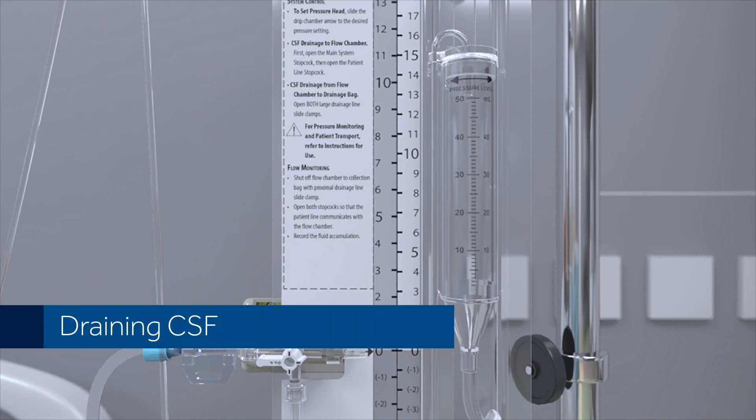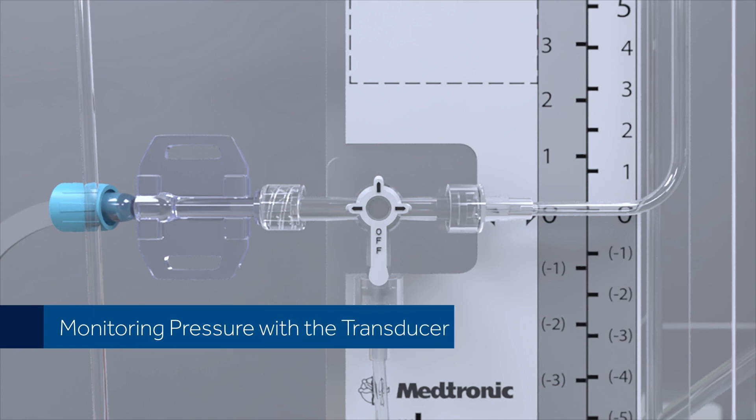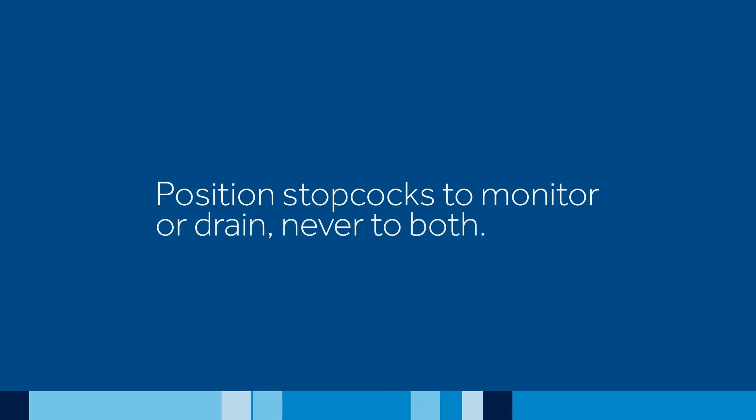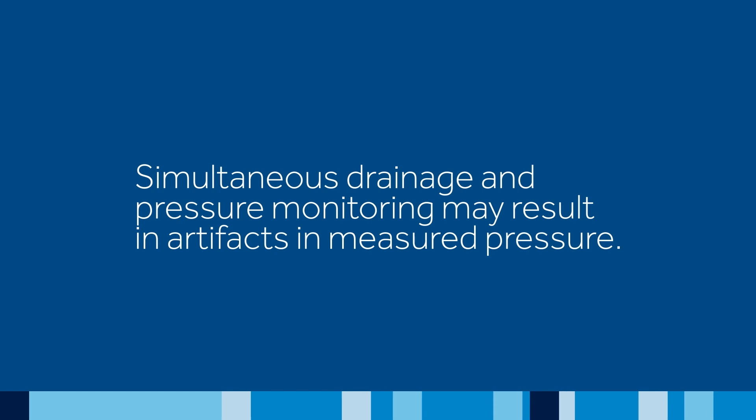Draining CSF. To drain CSF, position both the main system and the patient line stopcocks as shown. Monitoring pressure with the transducer. To monitor ICP, position patient line and main line stopcocks as shown, so that the fluid flows only to the transducer adapter. Position stopcocks to monitor or drain, never to both. Simultaneous drainage and pressure monitoring may result in artifacts in measured pressure.